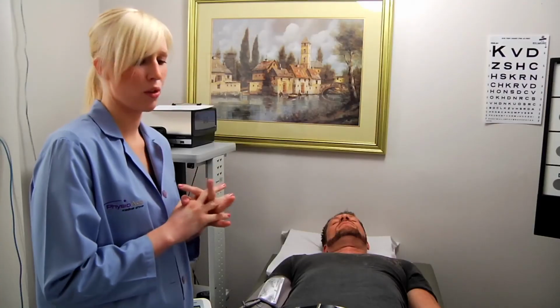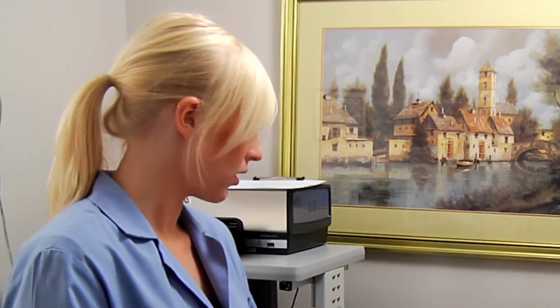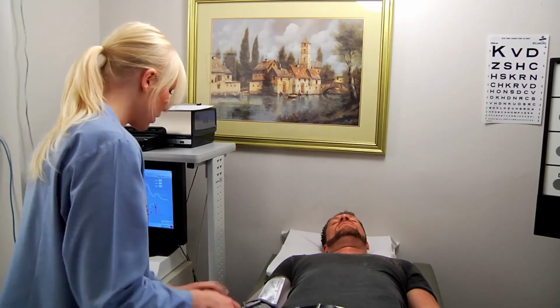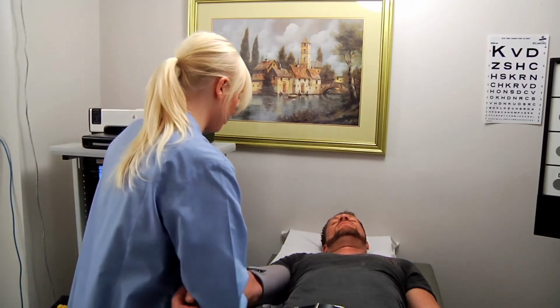When I came back into the room, the other thing I made sure is that the patient's legs were still uncrossed. Oftentimes patients will try to cross them when they're resting. So I make sure that they're uncrossed and everything looks pretty good. And I just wait for the blood pressure to be finished. As soon as I see the blood pressure, I take the blood pressure cuff off the patient.